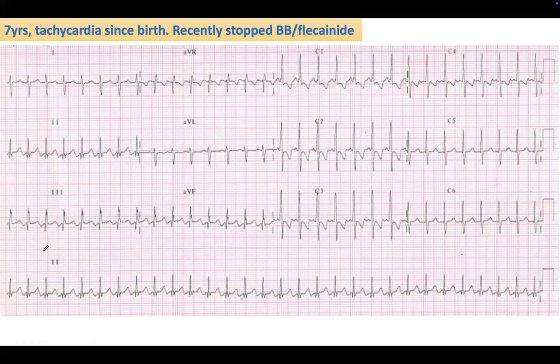It looks like sinus tachycardia. Okay, I heard sinus tachycardia. There are some P waves in V1, V2, V3. I heard, definitely tachycardia for age. Heart rate is maybe 170, 180.